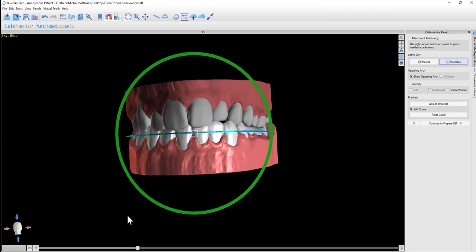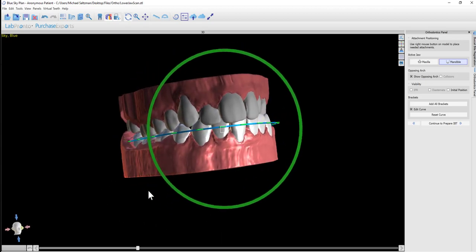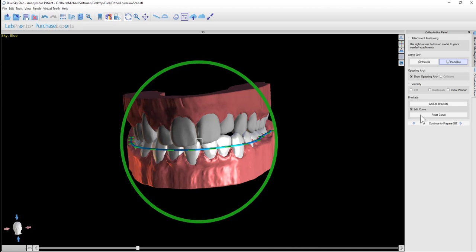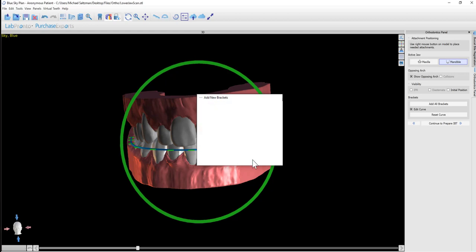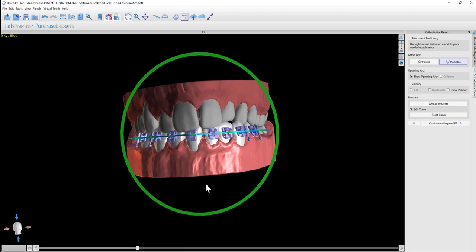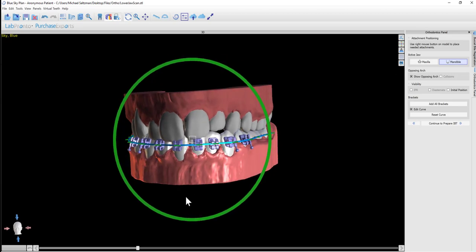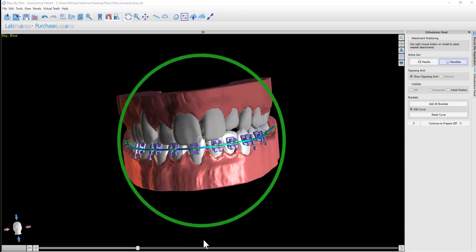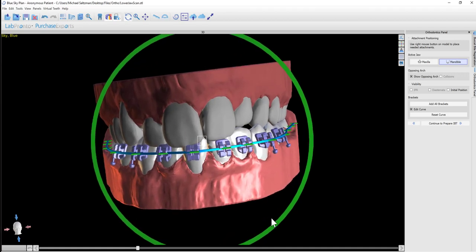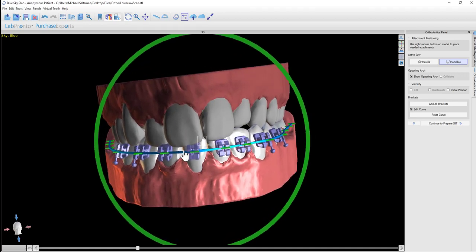Once we have the positioning of the brackets as we would like them, we can go ahead and click add all brackets. We can select the bracket type from the drop-down list and press the add button. The brackets are now added to the teeth, positioned by default so that the opening of the bracket is perpendicular to the wire.